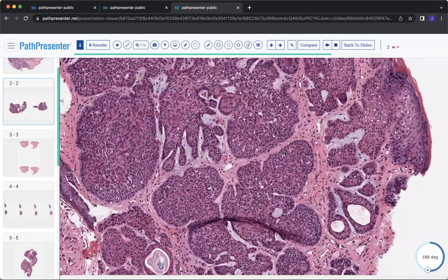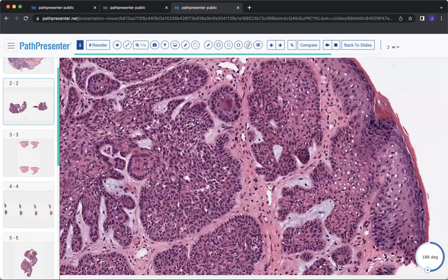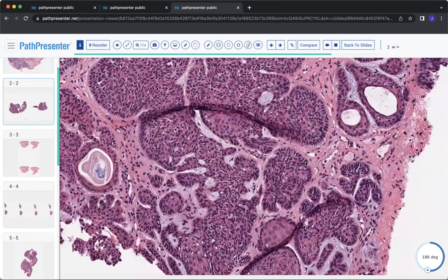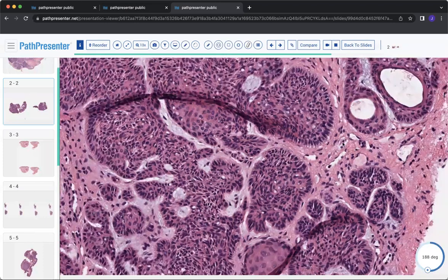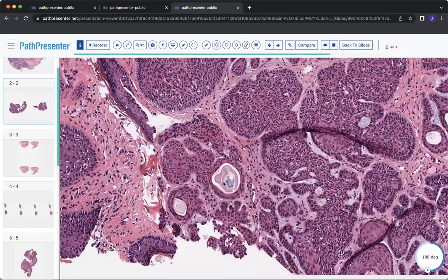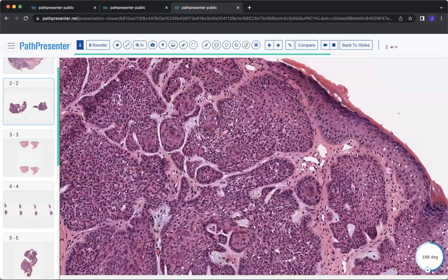However, if this were a young person and not in sun damaged areas and it wasn't really growing, it was just kind of sticking around for a while, and you got this type of histology and you're noticing that the stroma is directly adhered, like I said, you're seeing these multiple milia-like cysts, and you may notice that it seems to be recapitulating a hair follicle pretty well.